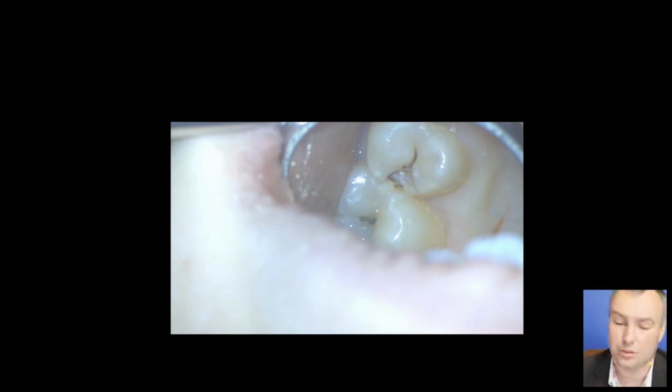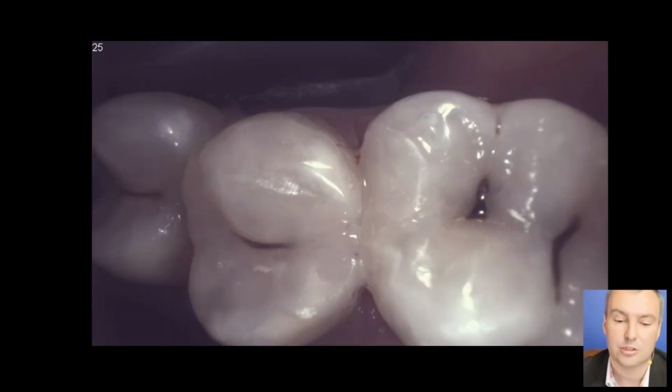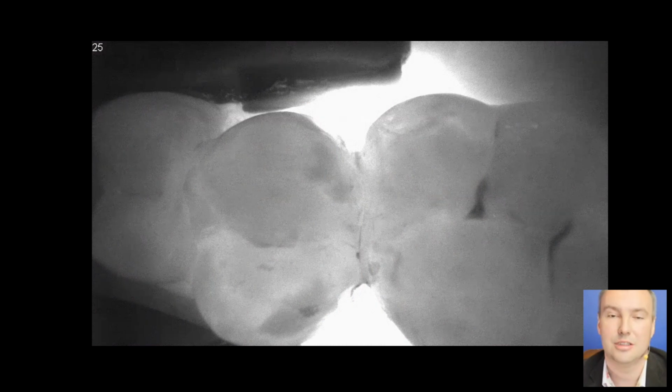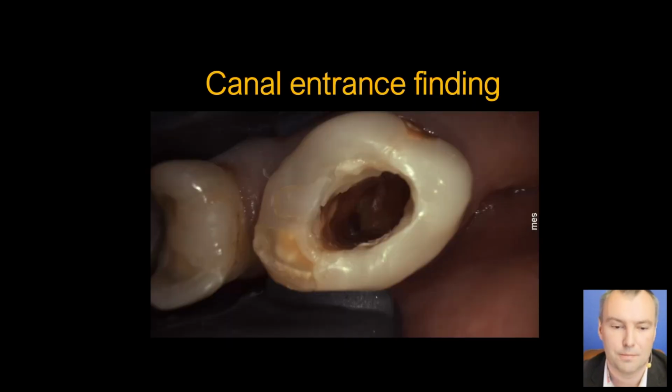Both of them look quite all right at the beginning. So then we make two fillings instead of one, sometimes changing the decision during the work, and we can present it to the patient in the fluorescence mode as two good looking fillings. Of course, with the intraoral camera our work is for those fillings not to be seen. With DiagnoCam, also not to be seen that there is any border. But with fluorescence, we can always see our fillings.